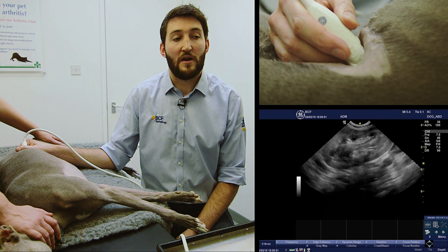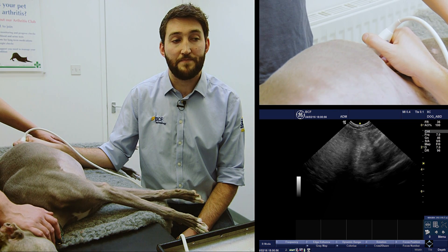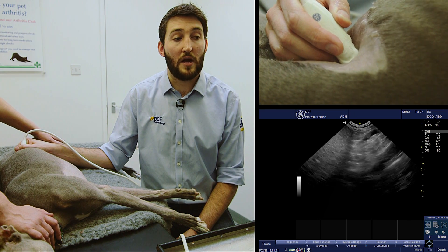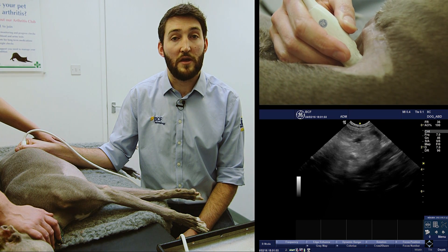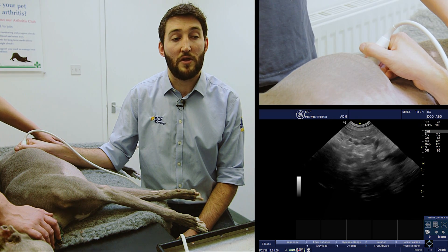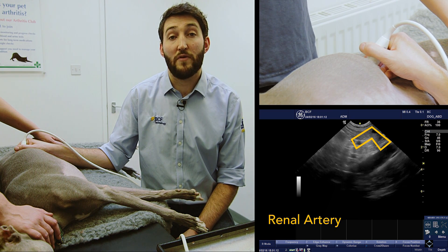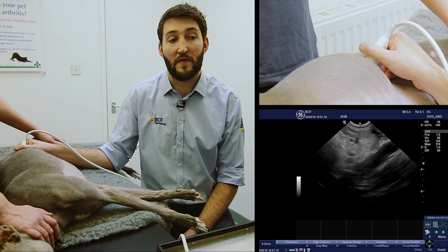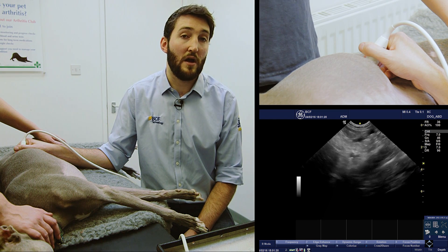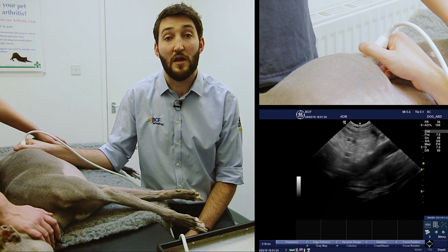We're then going to fan up dorsally away from us off the dorsal border of the left kidney. Once the kidney has disappeared from the image, we fan back down, keeping a close eye on the screen. What we're looking for is a vessel appearing in the image — originating off the aorta, you can see the aorta pulsing, starting caudally from the kidney and doing a 180-degree loop, heading cranially back towards the kidney.